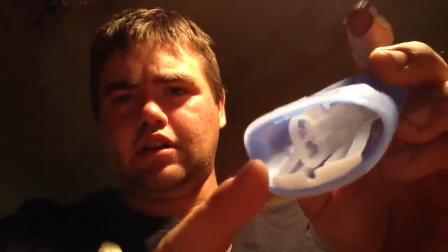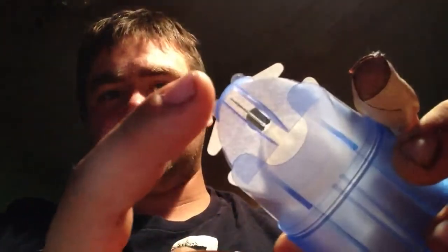And right here, all I do is pull that back after I take the cover off. And pretty good. So it's an adhesive under here, and that just sticks to my skin. It's pretty good, kind of like a bandage, maybe a little better than a bandage. There are some wipes that you can put, kind of a sticky thing. I'm not sure if they discontinued them or not. I don't really use them anyway.